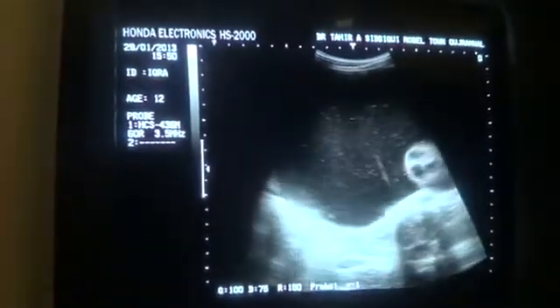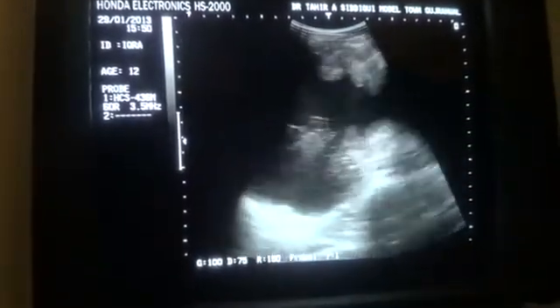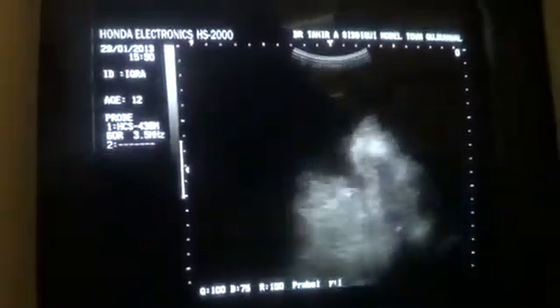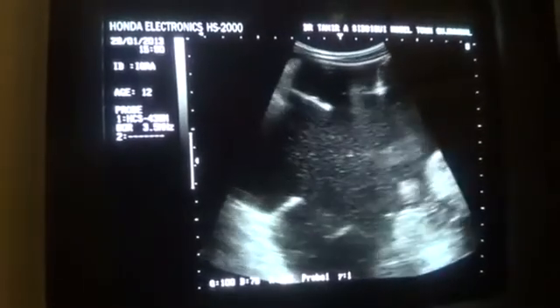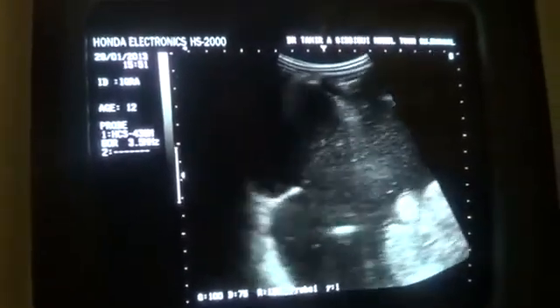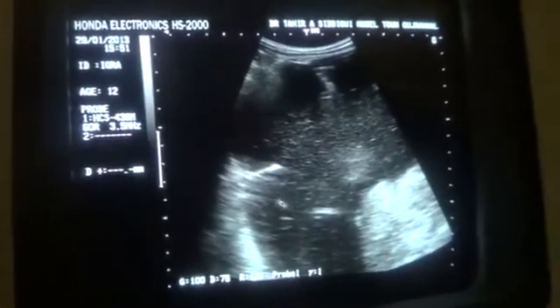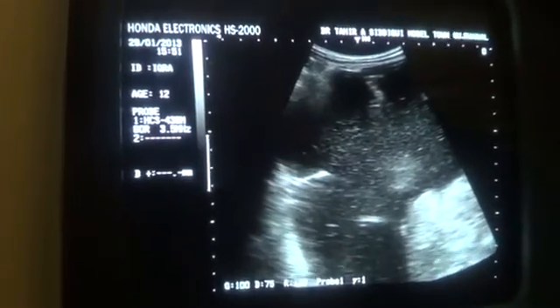Now this is below the epigastric region, and here you can see there are internal echoes in this cystic area. This is the area of the right flank. This is the area of the left flank. You can see the echoes and the septa. Now you see these are the incomplete thick septa. This is the incomplete thin septa. Same is the case here. Now this is the liquid portion of this. This is the portion with internal echoes.